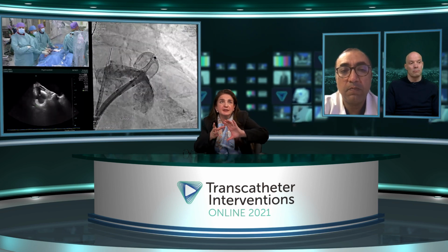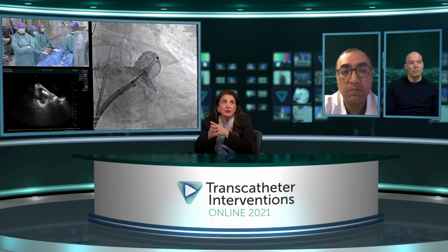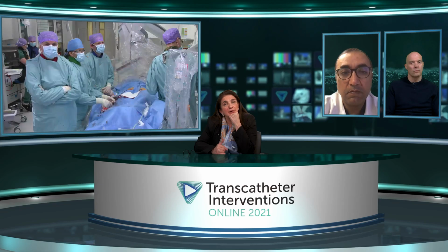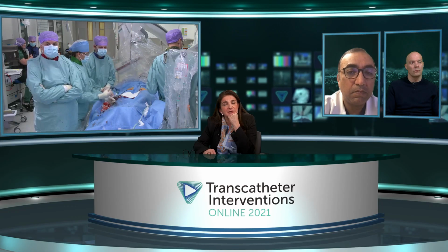We have Nicholas online here. And Nicholas, any thoughts about this? My one question to you was, if this is nitinol, I imagine this is nitinol, will the cup continue to expand? And what's the risk of compression down the line? And has that been evaluated? And then any other questions from the panelists?